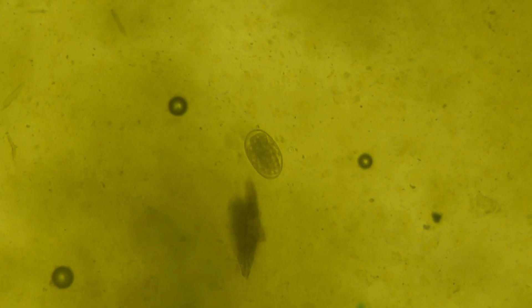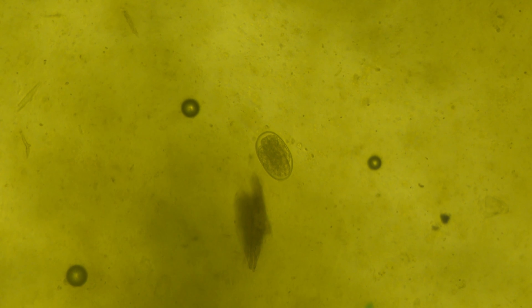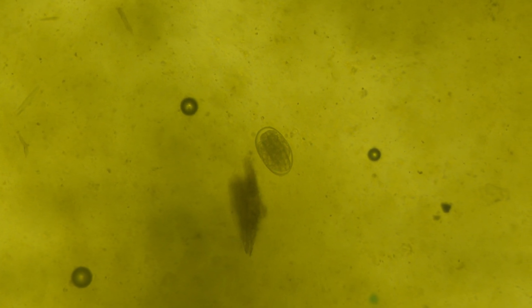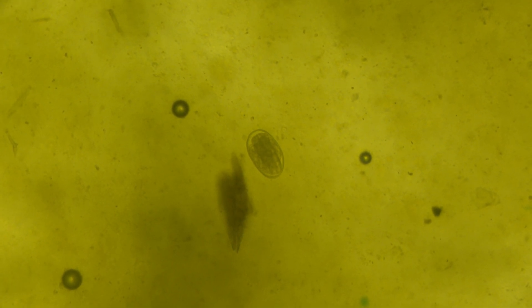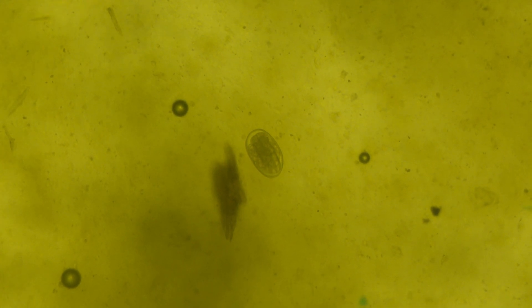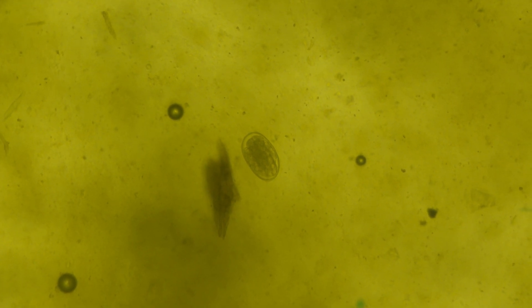Let me zoom in and show you what I'm looking for. What I'm looking for in these slides is what you see right there in the middle of the screen — that's a strongyle egg. The main cause of death and anemia in goats is the barber pole worm, which is a type of strongyle, and that's what I'm really counting. Some other worms don't even show up in a fecal test, but this is the one that's the main cause for concern. That little spot below it is just debris, and those little black circles with the light dot are just tiny air bubbles — nothing to be concerned with.